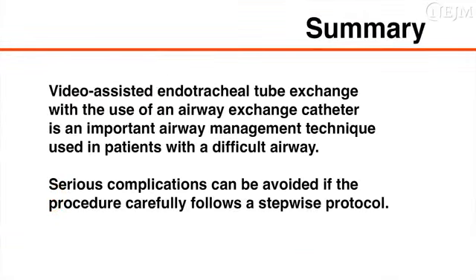Video-assisted endotracheal tube exchange with the use of an airway exchange catheter is an important airway management technique used in patients with a difficult airway. Serious complications can be avoided if the procedure carefully follows a stepwise protocol.